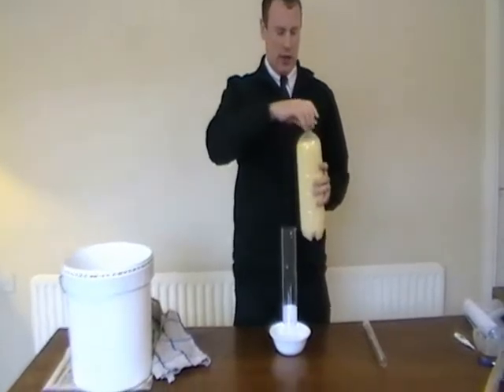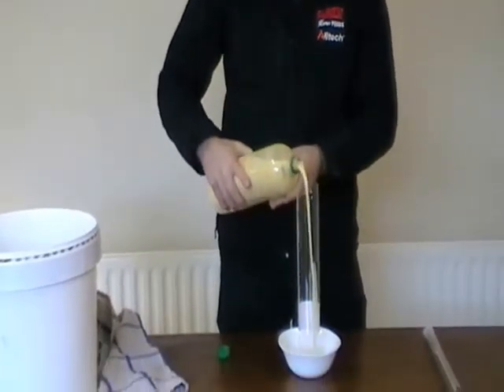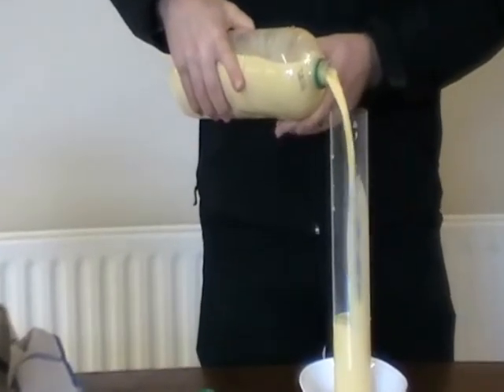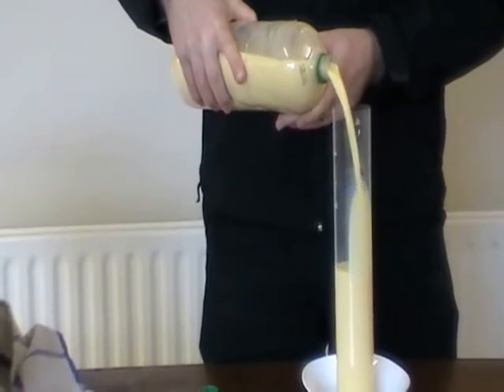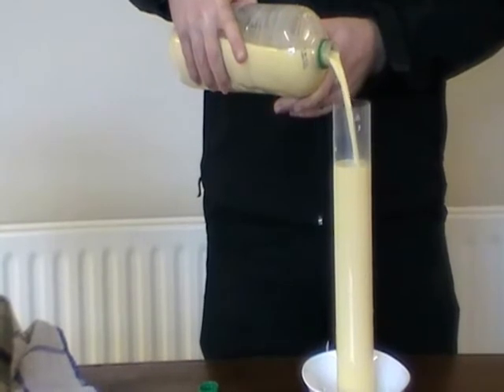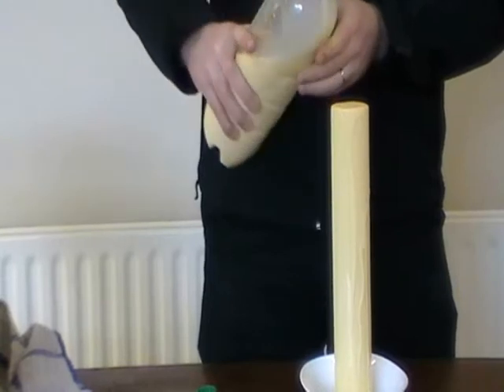Firstly, you need to take the colostrum and pour it into the cylinder, making sure that you fill the cylinder right up to the top. If it's a foamy or scummy colostrum, when you fill it up to the top and over, all the foam and scum will blow off the edge, which will give a more accurate reading. So make sure you just overfill it a little bit.